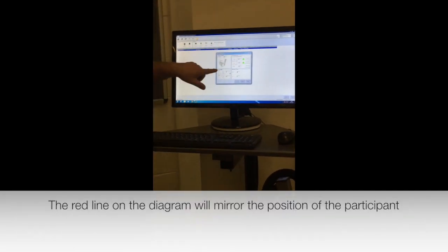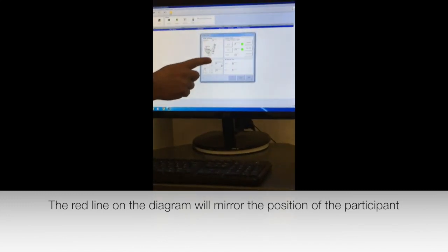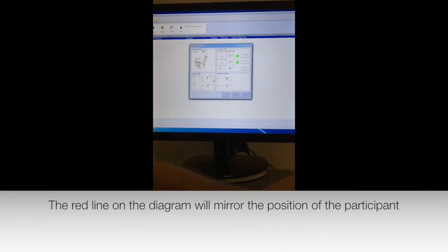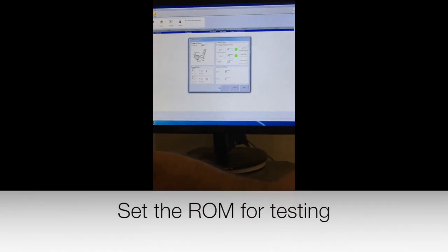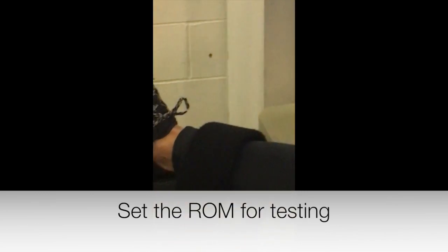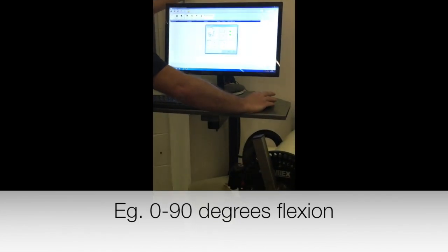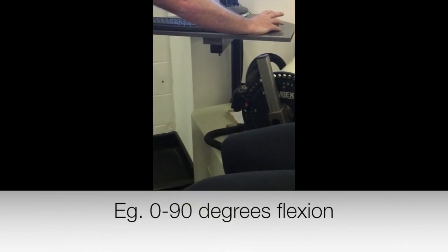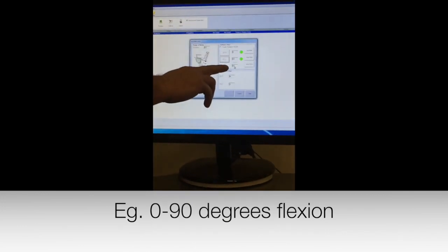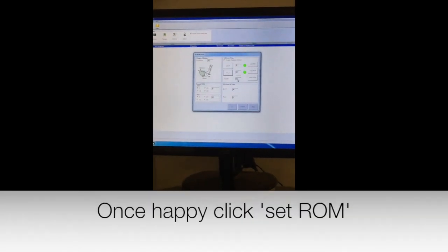So if you move your leg now, Steph, you see the red line moving? Yeah? So this is where you set the range of movement. So if you go to 0 again for me, so it says 0 there, click extension, that's set, bend your knee as much as possible for me. And again, the stop's getting in the way, so you might just need to take it a couple out of the way. Click flexion. It tells you you've got 82 degrees of movement there. So if you're looking at 90 degrees of movement, you're going to have to set it up so you get 90 degrees of movement.